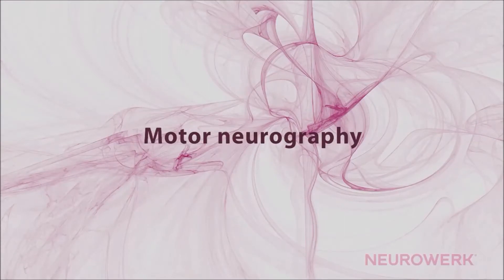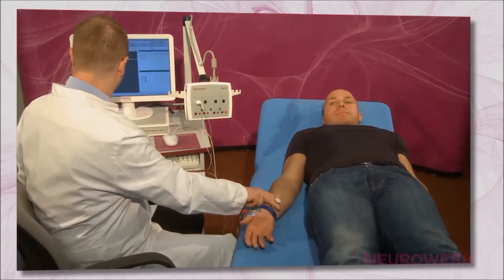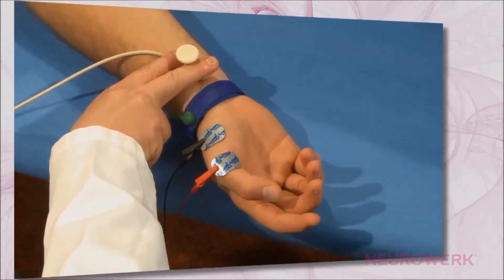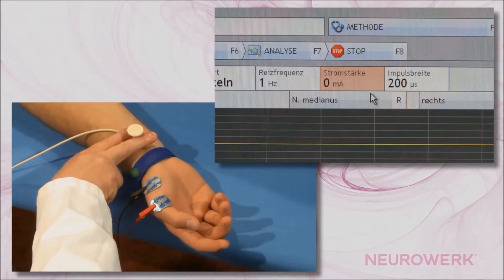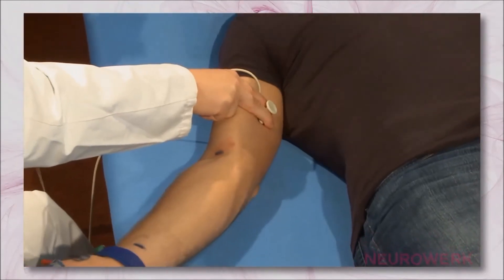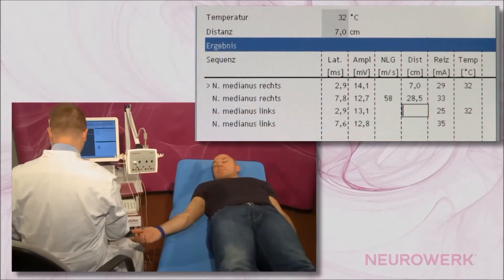Motor Neurography. The performance of the Motor Neurography is basically equal for all nerves that are available for this examination. Therefore, it is recommended to firstly analyze the examination by using the median nerve as an example. The techniques shown and described herein are essentially repeated in all other nerves, especially when it comes to the basic application of stimulation and recording electrodes as well as the method of distance measurement.